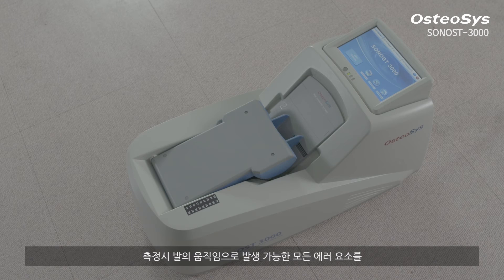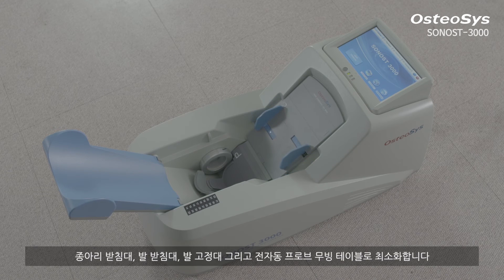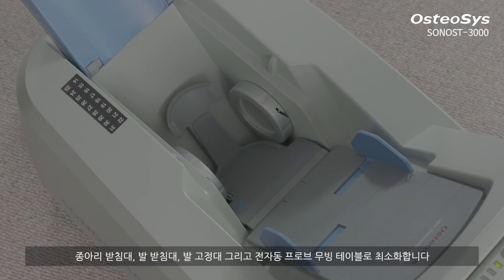Sonos 3000 minimizes the possible positioning errors by offering a calf supporter, foot positioner, foot supporter, and automatic moving probe table.